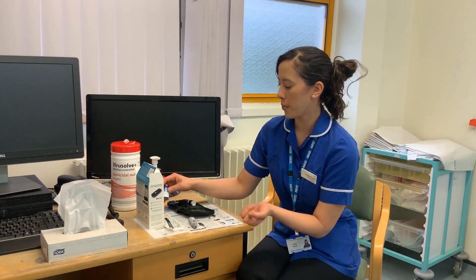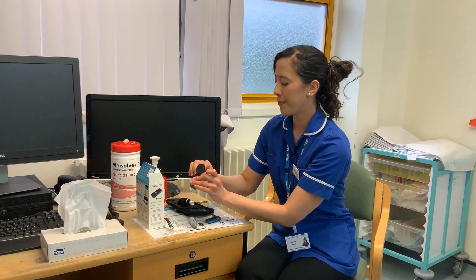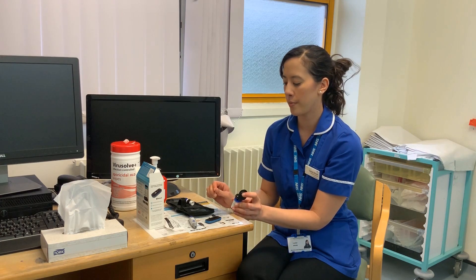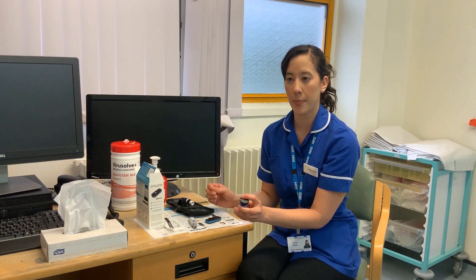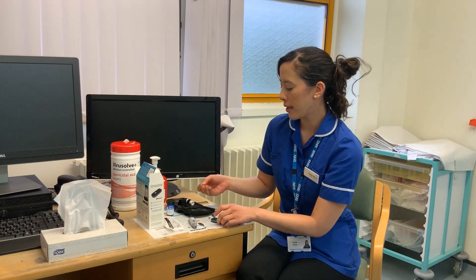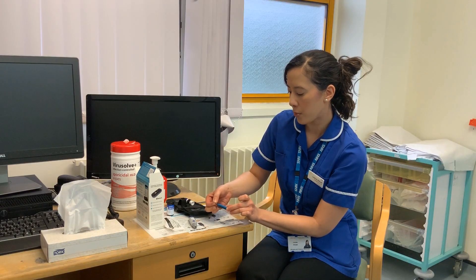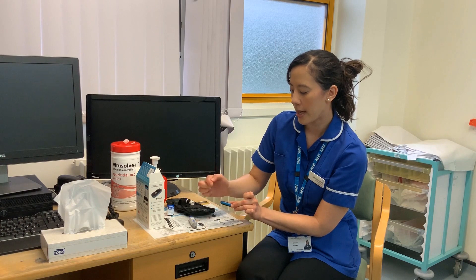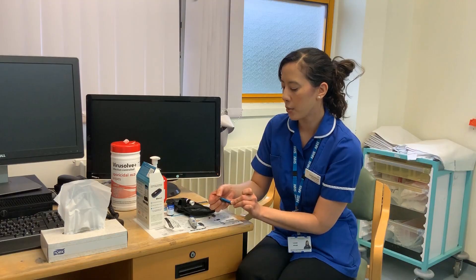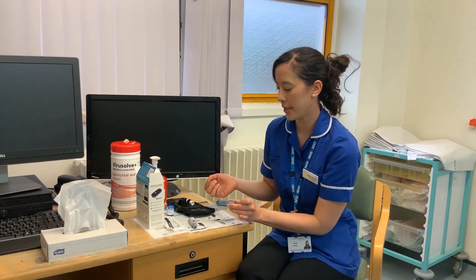Pop your testing strip into your meter first so it's ready. You've got enough strips and needles to last a good three days, but you'll need to get more from your GP. In your pack, you'll be given a letter to give to your GP to get more prescriptions. The testing strips go into the meter — the lines go in first — and just push it all the way in. Avoid touching the end of the strip as it may contaminate and affect the reading. Once pushed in as far as it will go, the meter will turn itself on automatically and you're ready to test.